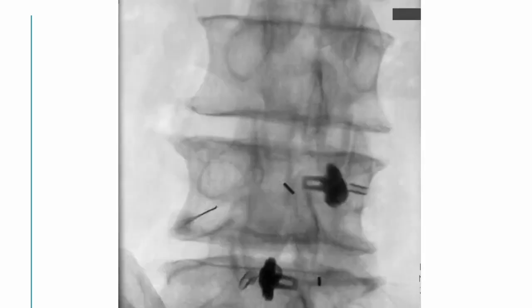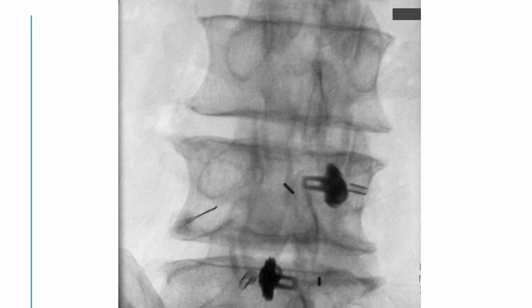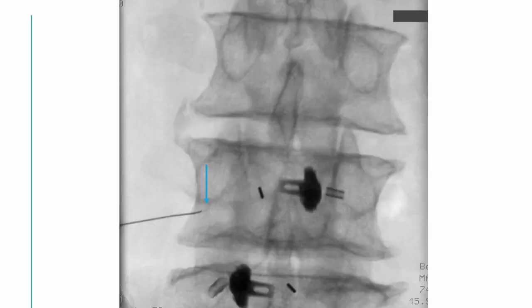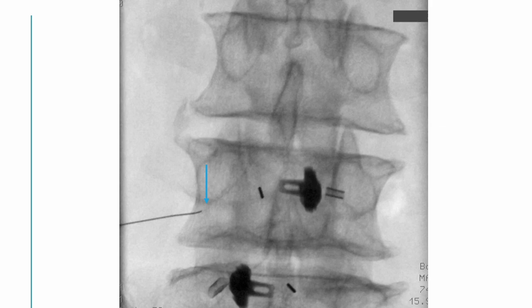Let's watch another side. It is an ipsilateral oblique view — it is less challenging. And I turn to the AP view, where the needle tip is in the 6 o'clock position.